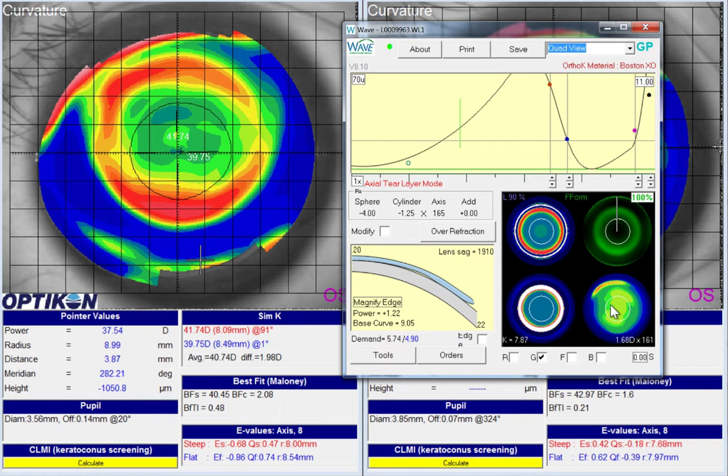I think if we get better, even though this cylinder, corneal cylinder, does extend past the center of the cornea, if we can correct half of it and get us around a half or so of residual cylinder, the patient should be okay without going to an oval treatment zone or toric treatment powers. So hopefully that's helpful.